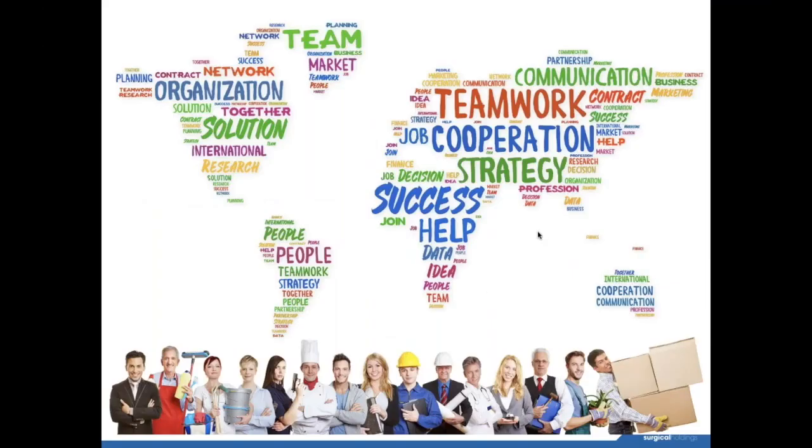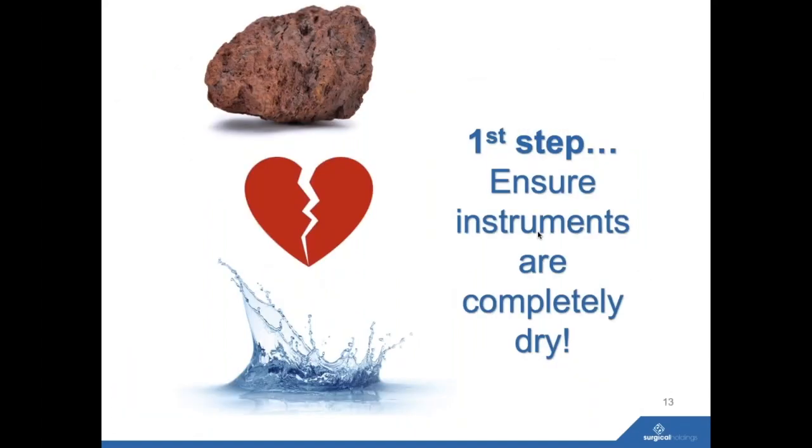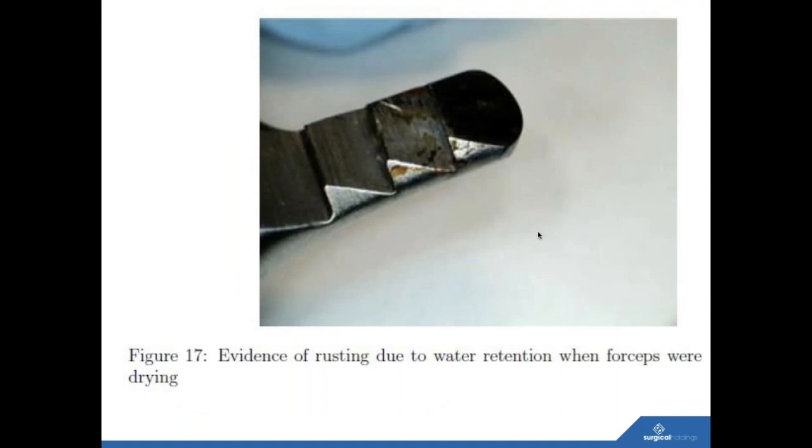So what we have to do is play our part, and be the bad guys in this relationship. That's everybody from sterile processing to surgical instrument technicians to theatre managers, all stakeholders involved in handling surgical instruments. I guess more so from a sterile processing point of view, the first step to breaking up this love story is to make sure that the instruments are completely dry. That means completely dry when they come out of the autoclave, and also when they come out of the washer disinfector, because we want to ensure that there's no staining on the instrumentation. You might see things like this, which is quite a common thing and easily missed on racks where perhaps they've been left wet. The instruments are then closed up and autoclaved, and when they're inspected, you see this water staining here. So this is quite commonplace.